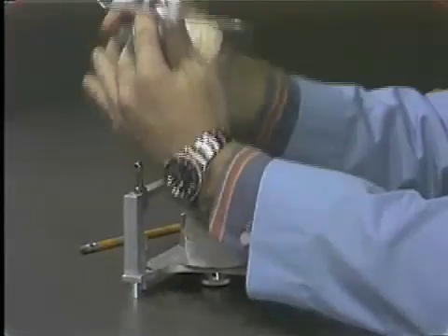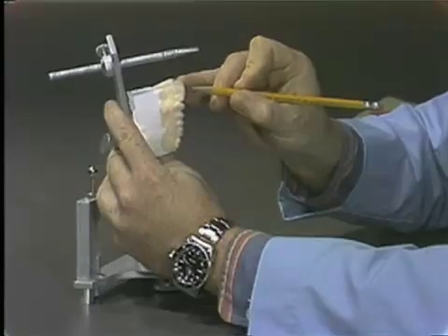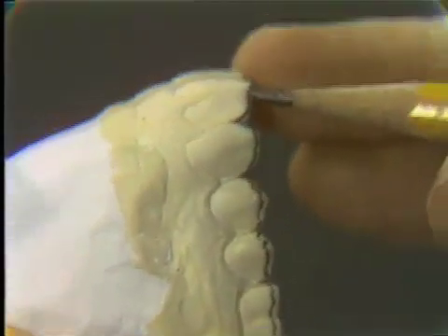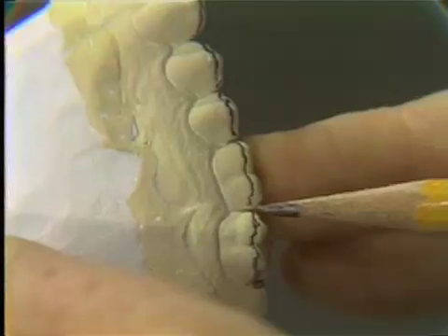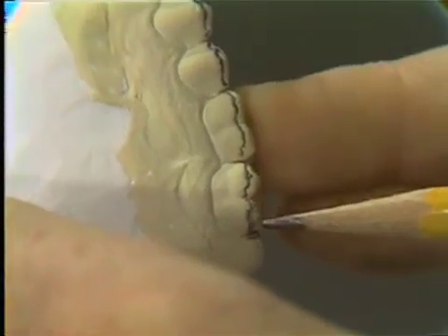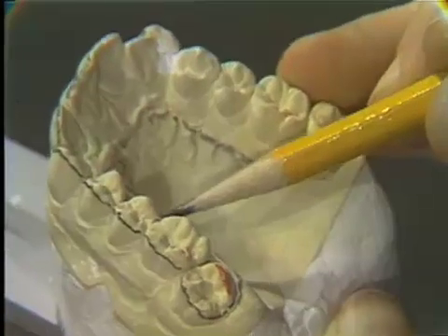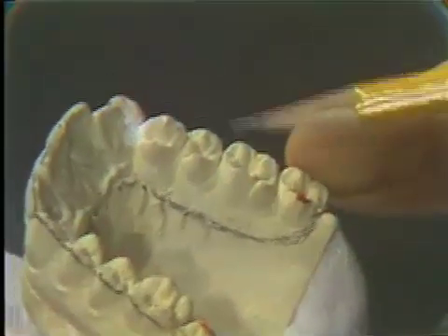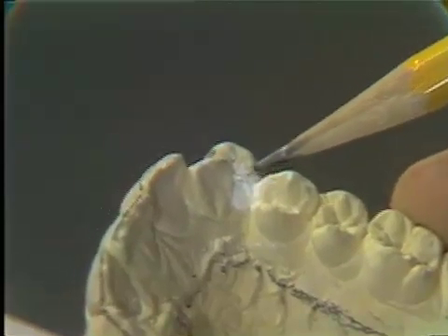The next stage is to outline the splint. In the incisor region, one to two millimetres of coverage is all that is necessary. As we go posteriorly, two to three millimetres in the bicuspid region and three to six in the molars, depending on the retention that is necessary. On the lingual aspect, about six millimetres of palatal coverage, tucking this line away from the tongue.